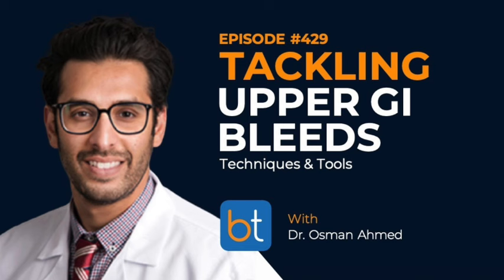Yeah, exactly. Most of the people that come on the show say they're using detachables, with non-detachables in select scenarios for cost reasons, right? And they still serve a purpose. But there is new stuff on the market.